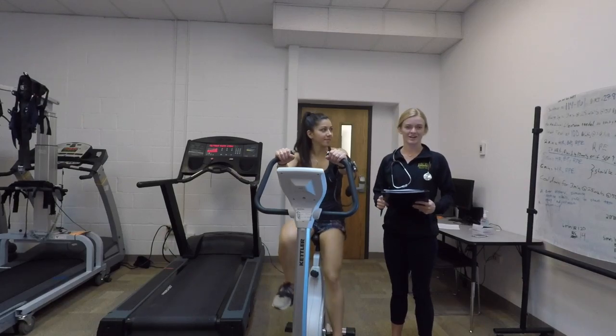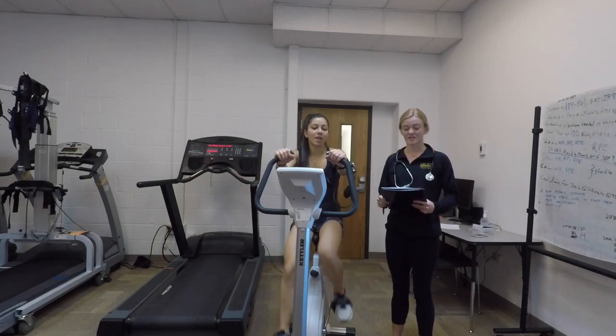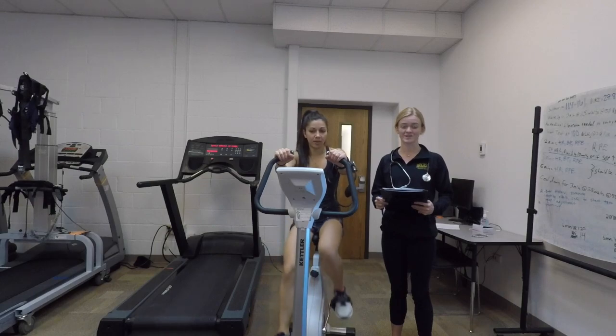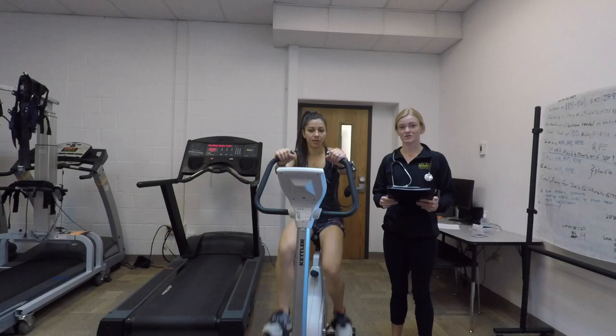Hello, my name is Michelle and I'm a student physical therapist, and today I'll be conducting an Astrand Cycle test with my colleague Alyssa here. This test is going to help determine VO2 max based on some vitals that I gathered during this test. Prior to warming up, I measured her resting vitals.